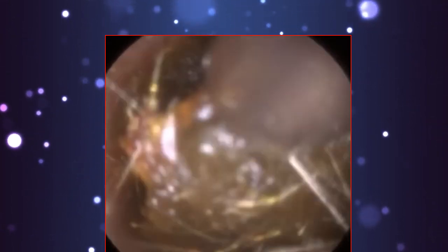So we've got the lateral wax out. So all this wax is beyond the second bend now. We're just loosening it off the anterior canal wall. So when we say the anterior canal wall, we mean the front part of the ear canal. So the front part of the ear canal in the case of the left ear is on the left hand side, and the anterior canal wall in the case of the right ear is on the right hand side, and vice versa for the posterior canal wall.